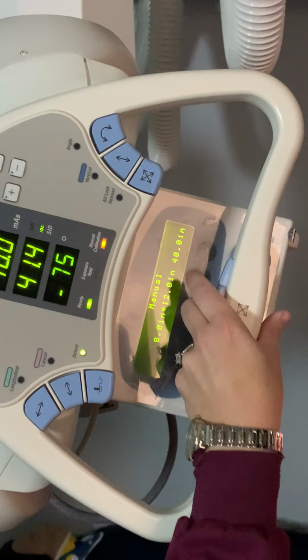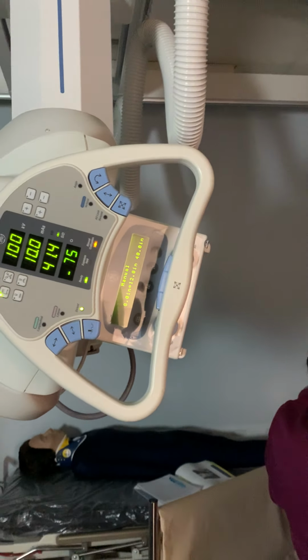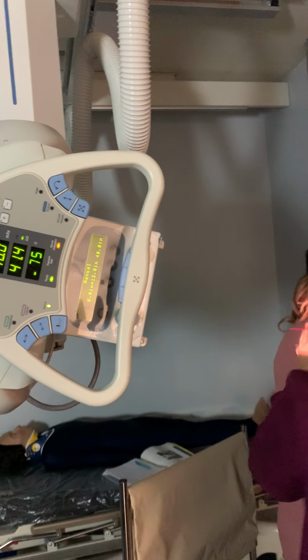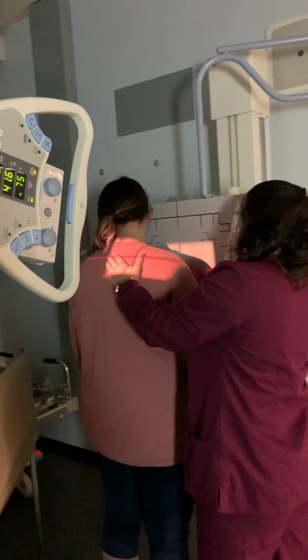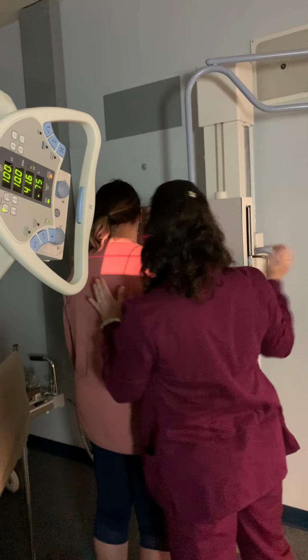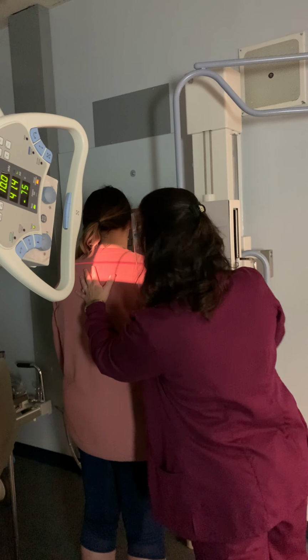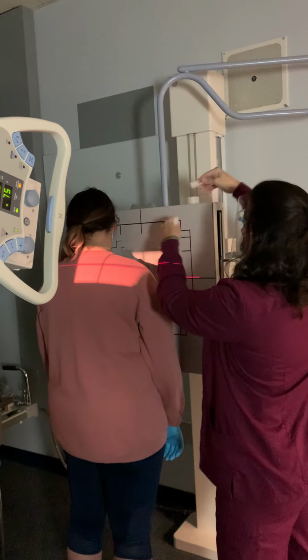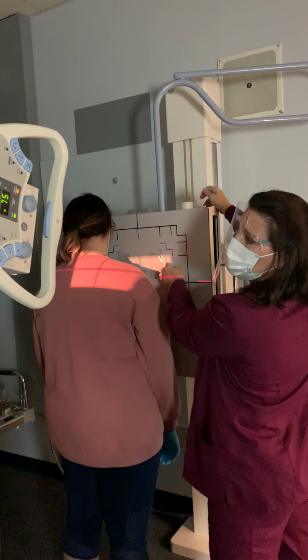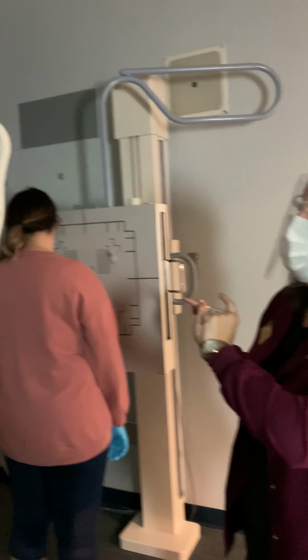And it's gonna make a liar out of me, isn't it? Maybe it's their 72 inch SID that does it. It's one of our angles, it might be 72. And then I would mark this with the right marker. Did that hold? That did hold. So the 40 inch holds that way.